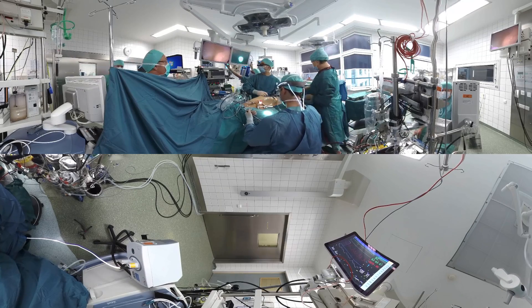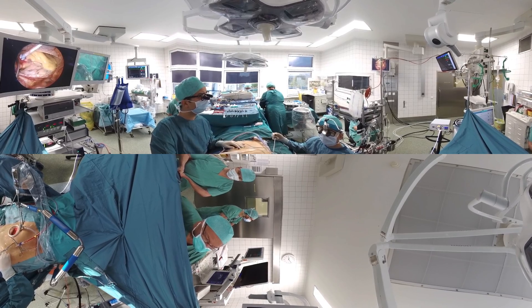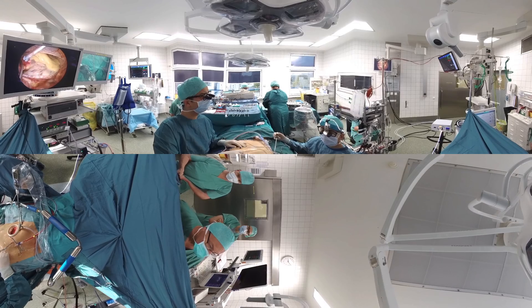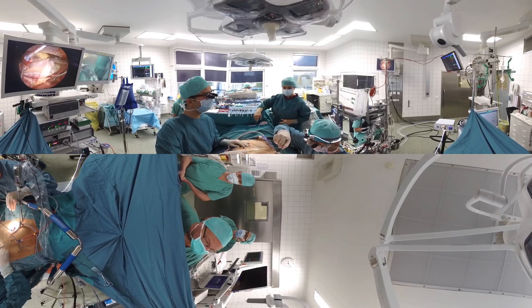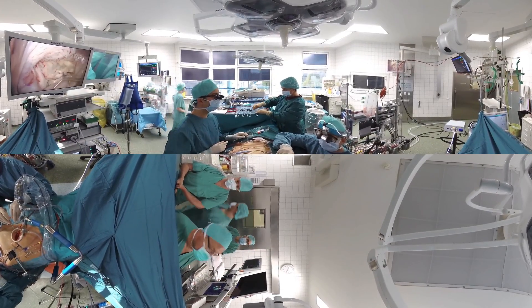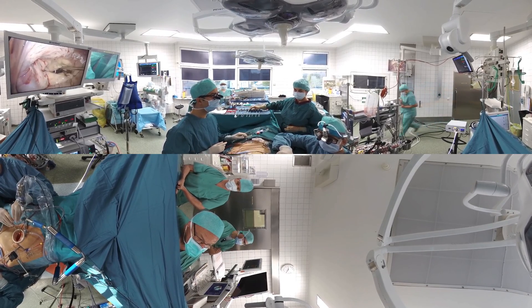Special surgical instruments, including a thoracoscopic camera, are used to gain access to the heart. A high potassium solution is given into the aorta in order to temporarily stop the heart from beating. Once the heart has come to complete arrest, the left atrium is opened and the mitral valve is exposed.